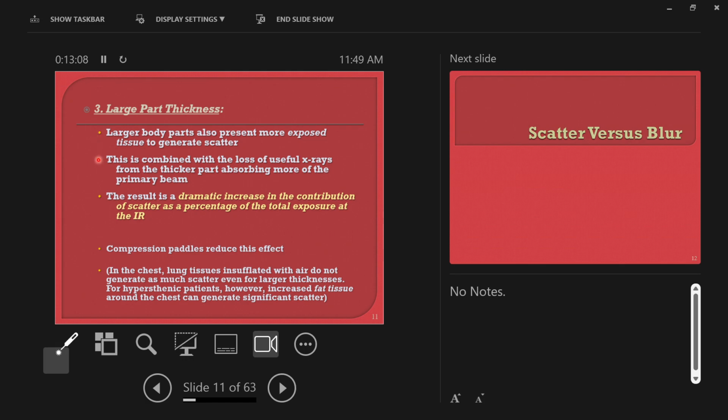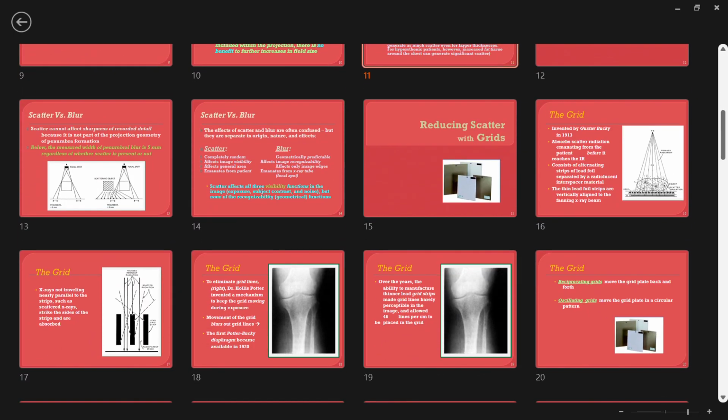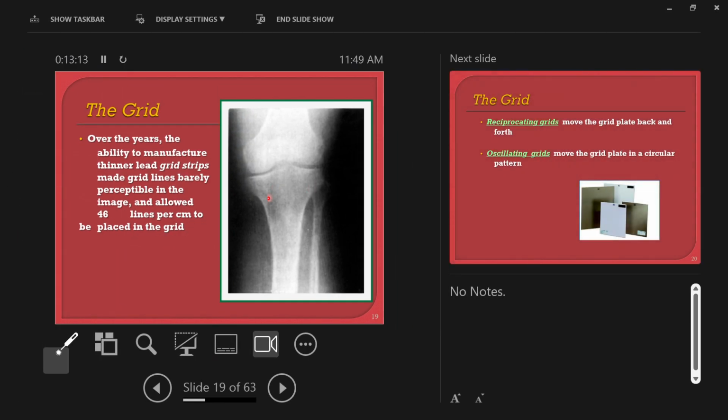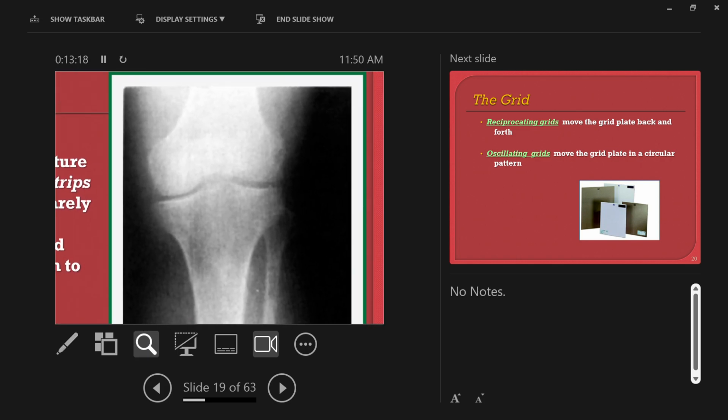Remember, let's go back to an image, right? Any image, I don't know, this one, okay? Ignore the words and just look at the image. In fact, let's just zoom in on it. That's a body part, a knee, right? And if you look at just any square centimeter, like that square centimeter, right? What you see is two-dimensional. It's that way and that way, right? But what it represents is three-dimensional. Yeah, that part has a thickness to it, okay?